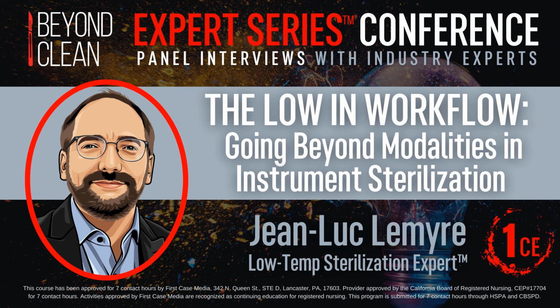So we start by vacuuming the chamber. There's a strong pump that would remove all of the air. The goal is to try to remove all air in the chamber, in the device, in the packaging, and get to a very low pressure, a deep vacuum. It's typically around 1 torr or a bit lower for some sterilizers. So that sets up the stage for sterilization.